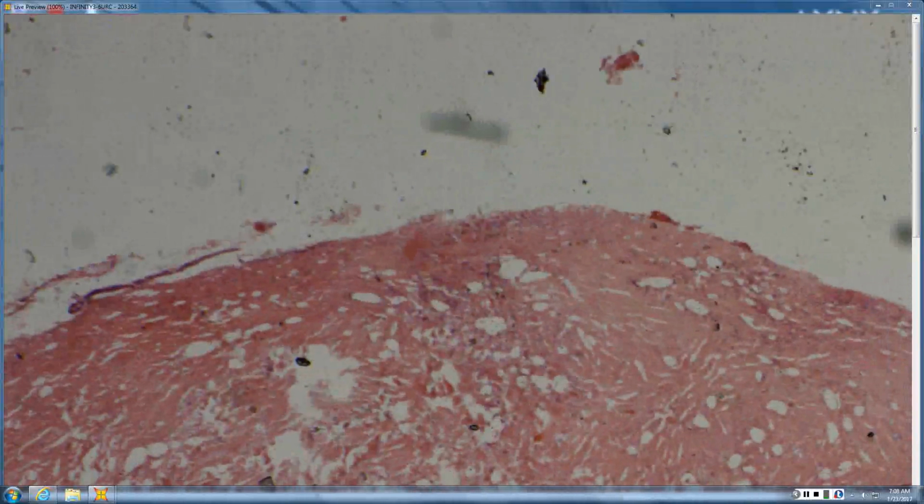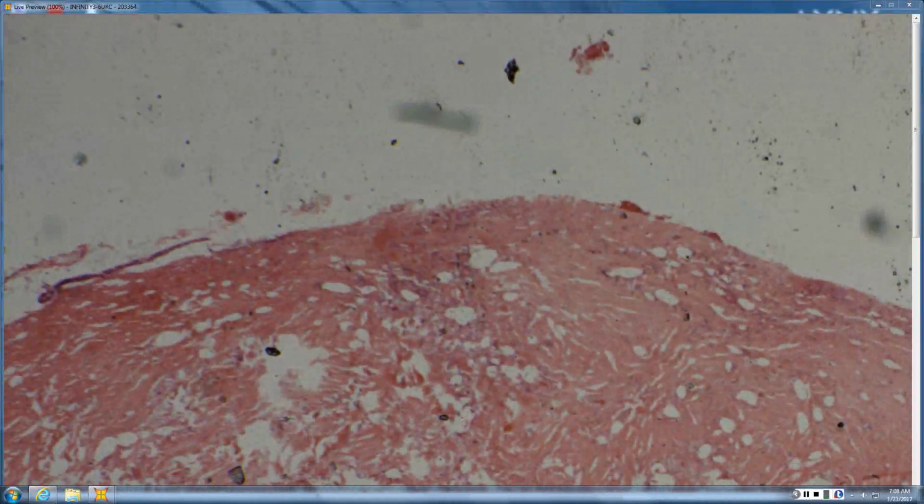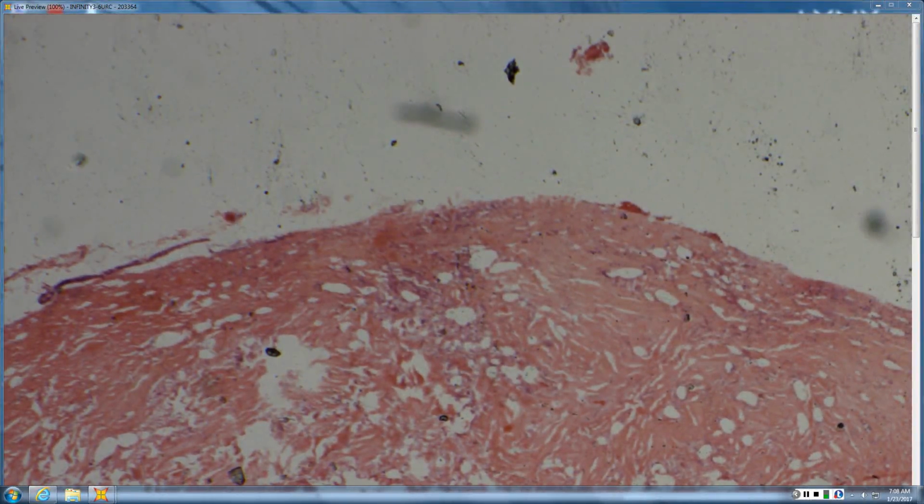So this one, you're supposed to kind of think about Swiss cheese. When you look at this, there are all these little circles of varying size. Right? These guys are all different. Some big ones, some small ones. And when you start seeing that, you start wondering about a foreign material or injection.